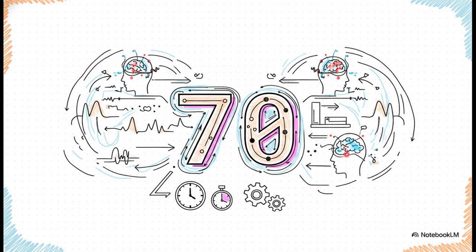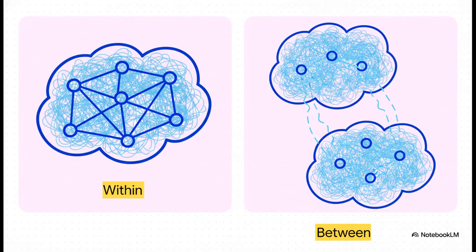constant monitoring. For the analysis, the researchers focused strictly on oxyhemoglobin, or HbO signals, because it's such a sensitive indicator of task-related hemodynamic activation. The core methodology for the validation is straightforward but extremely powerful. They basically compared 2 metrics.